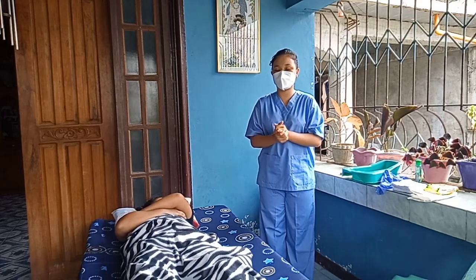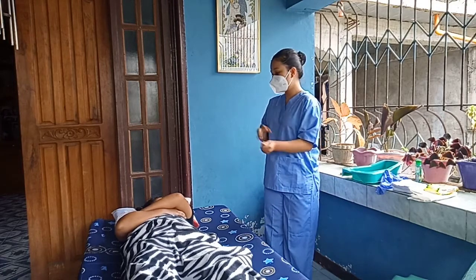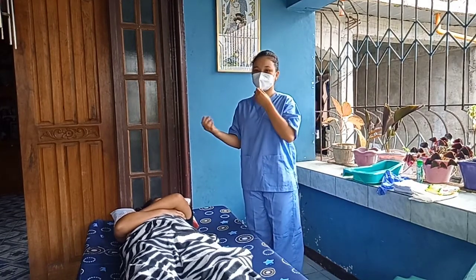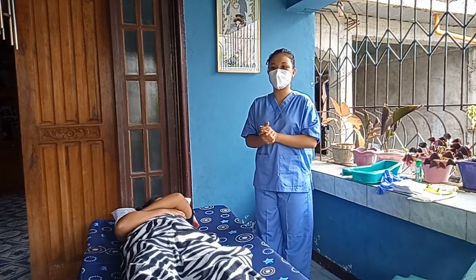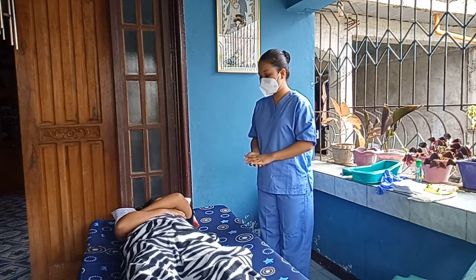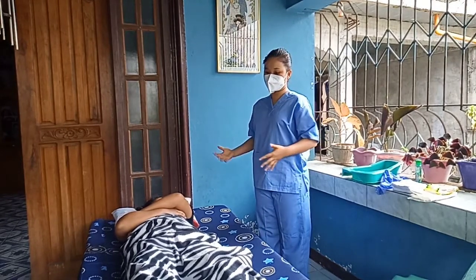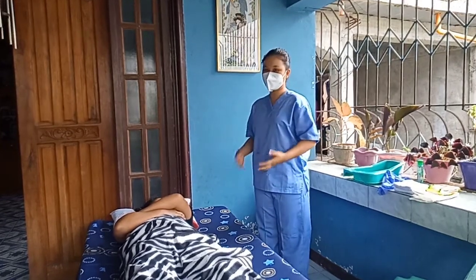So, next, number 3 is raise bed on opposite side. So, assuming that I already raised the bed on the opposite side, raise bed horizontally according to nurse's height. So, assuming po ulit na I already raised the bed to the nurse's height.